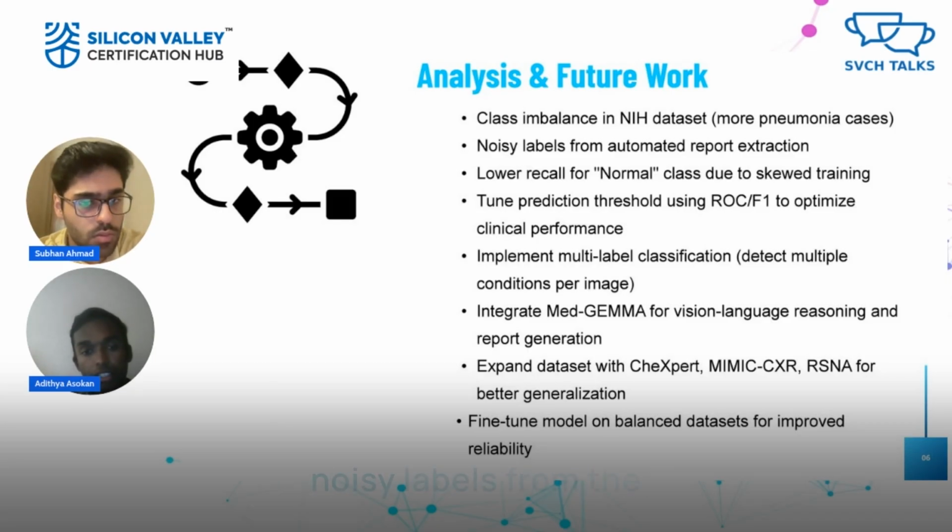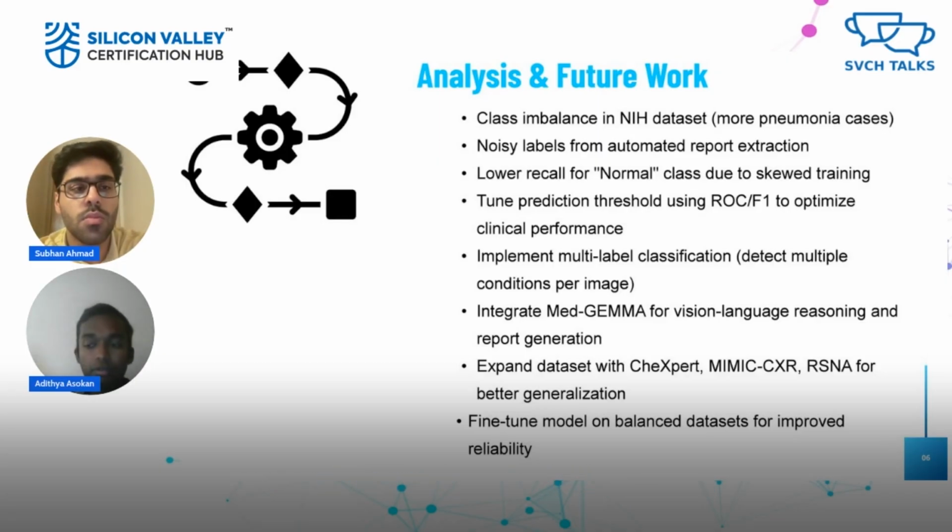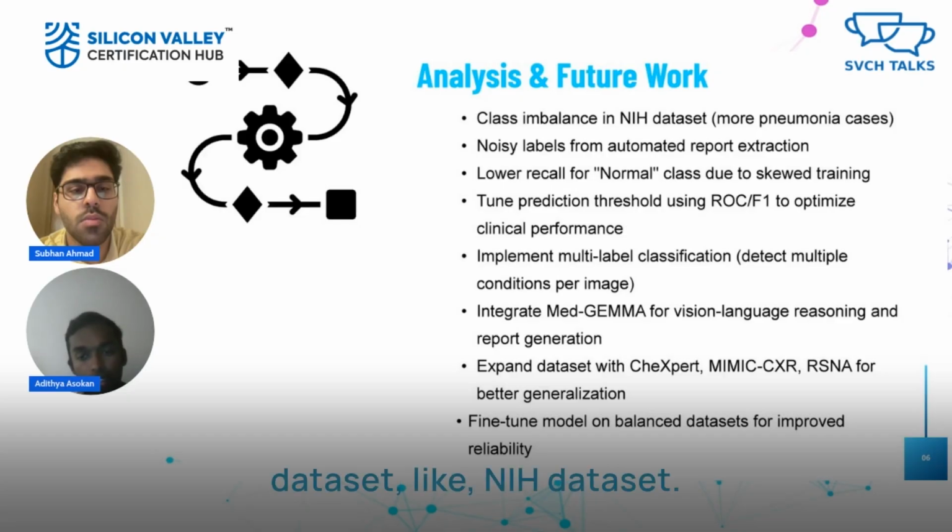And there were noisy labels from the automated report extractions. We found many images which are supposed to be normal that were detected as pneumonia in our NIH dataset.